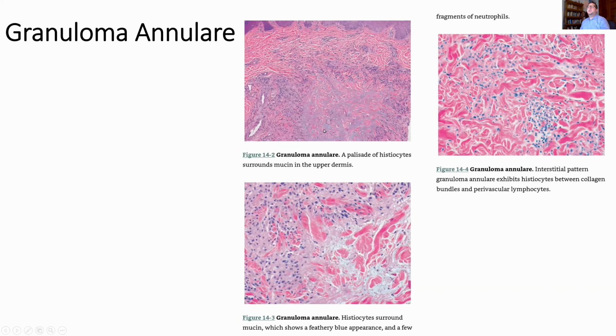So the necrobiotic is this, where you have the degenerated material in the center. These are kind of the same, and you can see here's degenerated cells. We don't know that these are necessarily neutrophils, this material here. We always assume because neutrophils fall apart so easily, but these infiltrates generally aren't marked with a lot of neutrophils in them. You can see them, so you can't be too concrete about it.